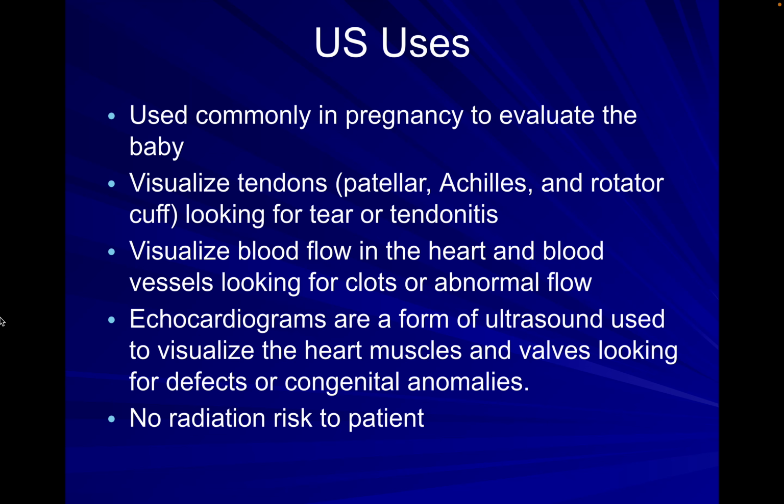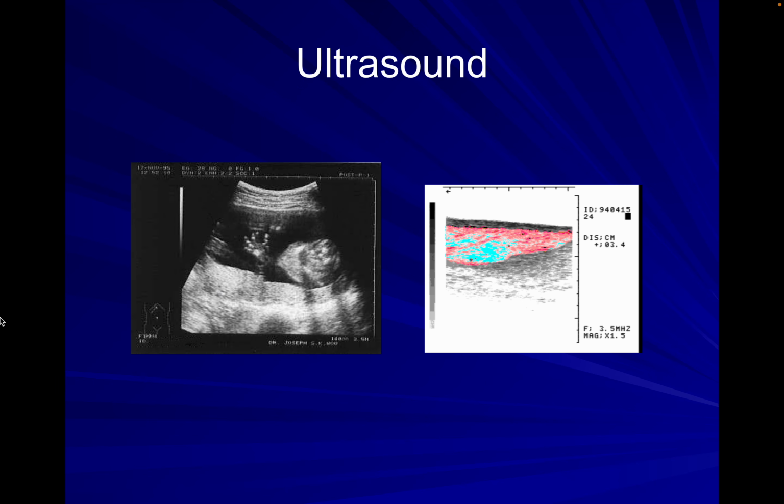And one of the really big advantages here is that there's no radiation risk to the patient. And as these tools and this technology becomes more accessible and affordable, it tends to be much more applicable at the point of care. And the provider, the physician, PA, the athletic trainer, physical therapist, etc., may have a lot more access to this in the coming years. And I think you'll see a lot more musculoskeletal professionals developing a real skill set with point of care ultrasound.